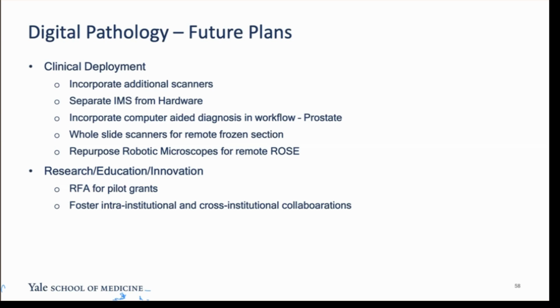As I said before, we have given up on robotic microscopes as a solution for remote frozen section. Instead of that, there are newer platforms in the market today that are specifically catered to the remote frozen section use case. And we intend to start incorporating that for remote frozen section evaluation. And the plan with the robotic microscopes, as I said before, is just to repurpose them for rapid on-site evaluation, remote ROSE. And in terms of research, education, innovation, obviously all of that continues.